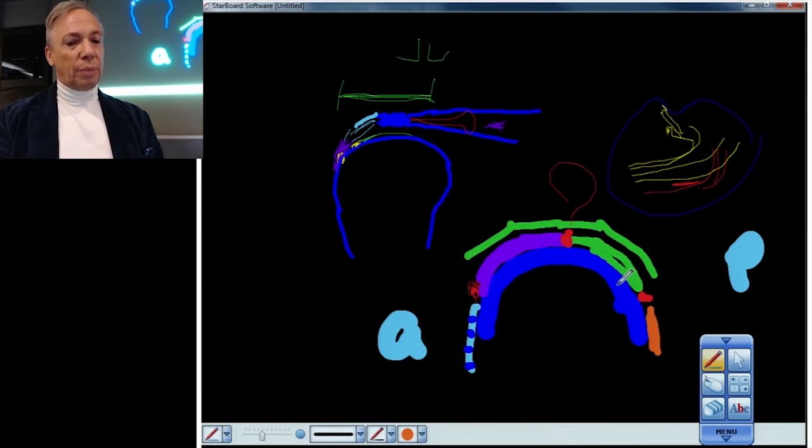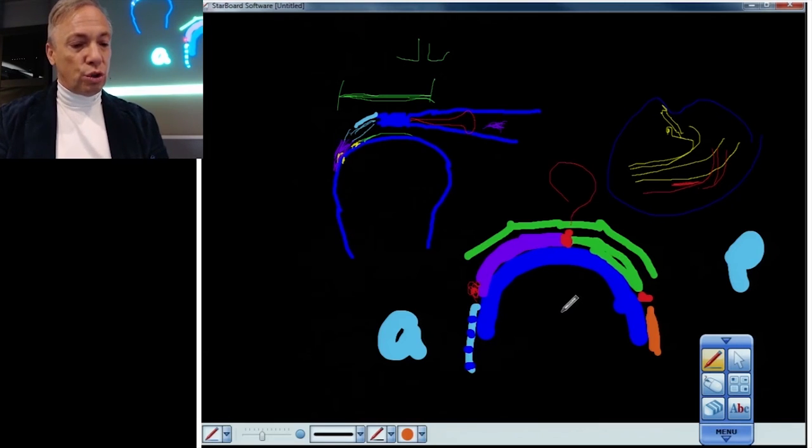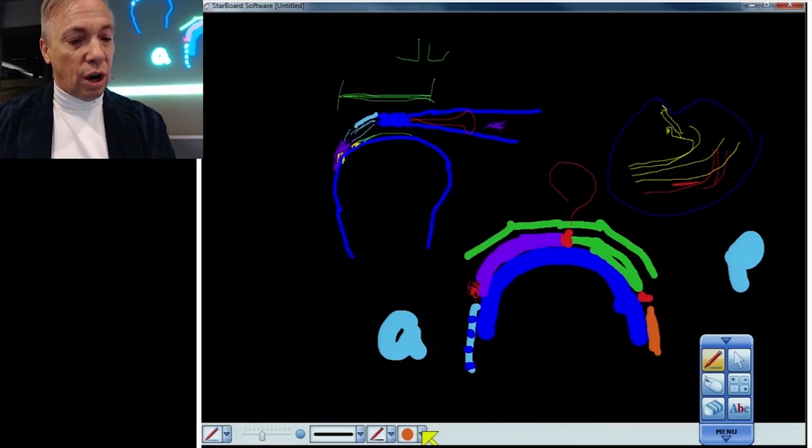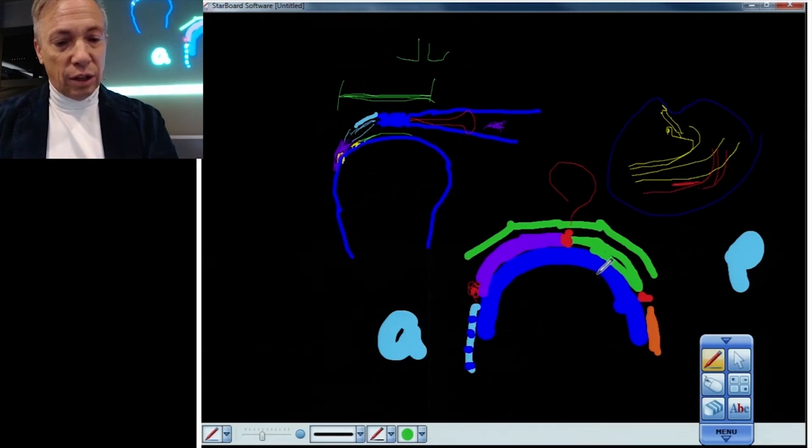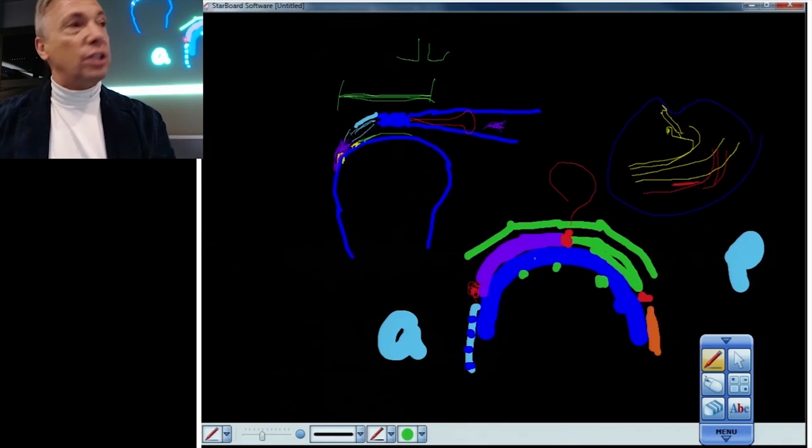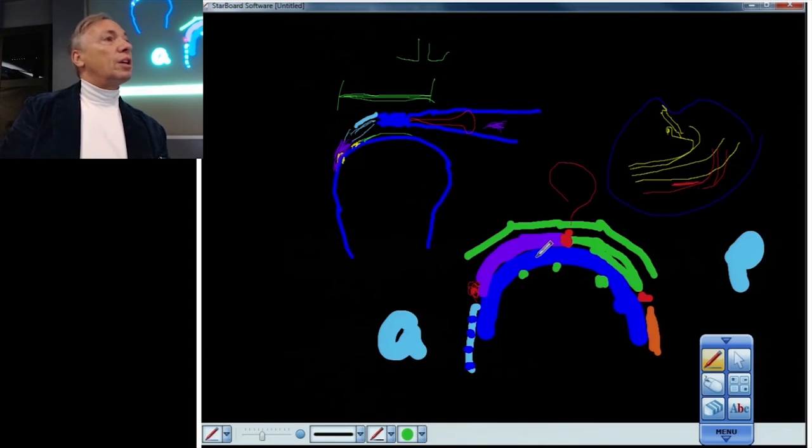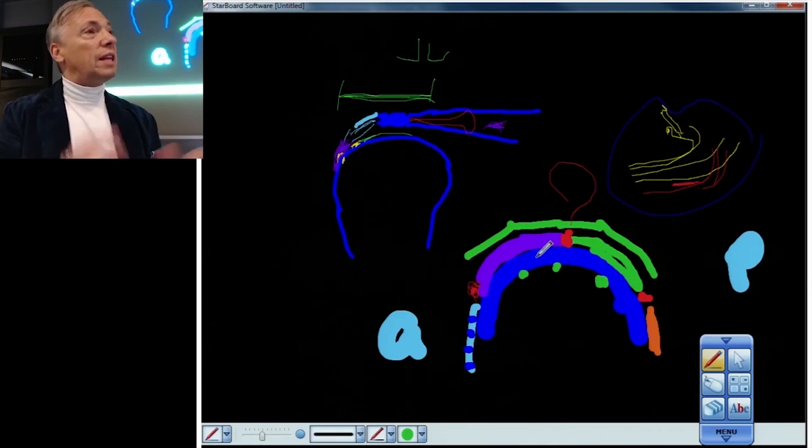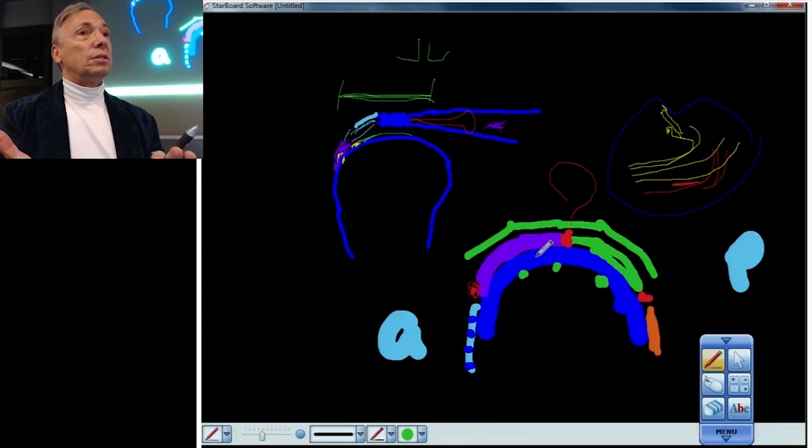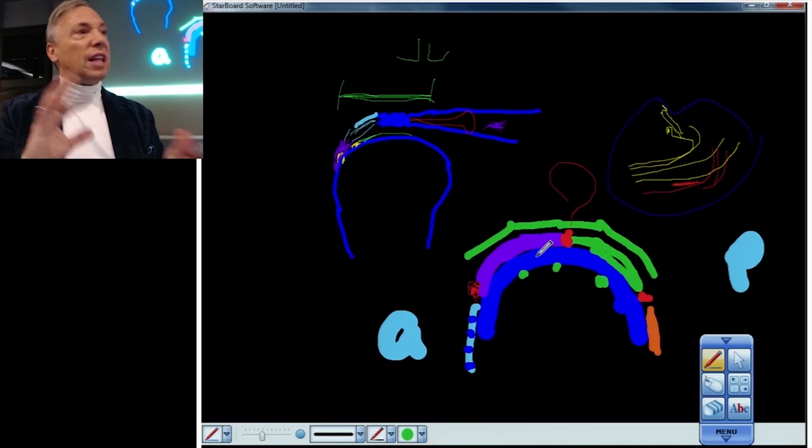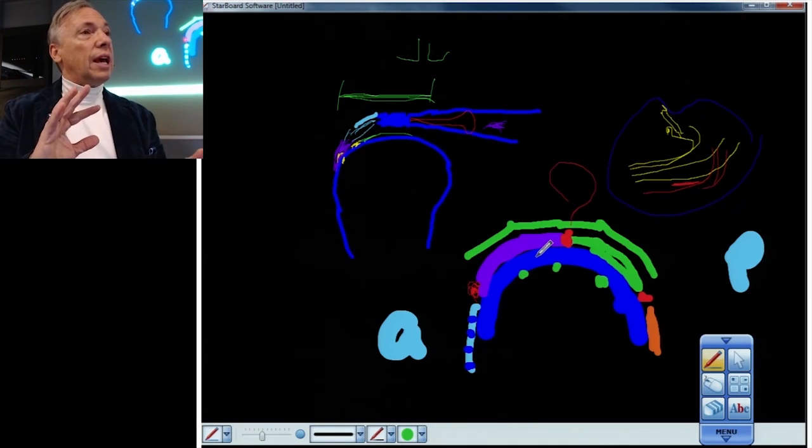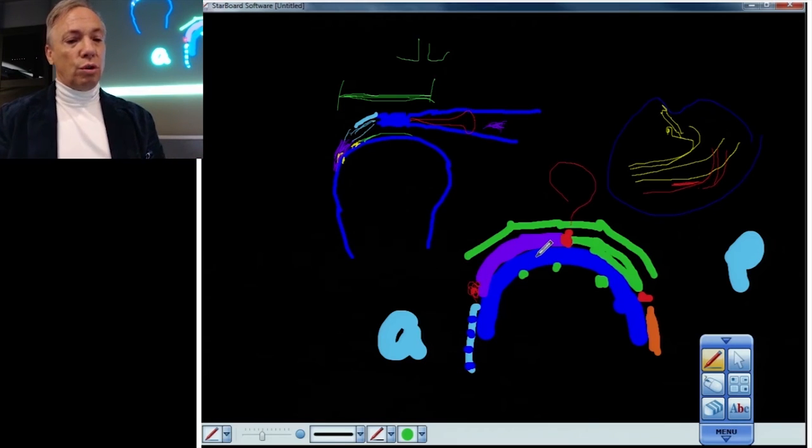This is also a great projection to assess where your PITS or pseudo cysts. And you know they look somewhat like this, either irregularity or you actually see subchondral or subcortical cysts. And they tell you kind of what's going on physiologically and pathoanatomically with the shoulder.